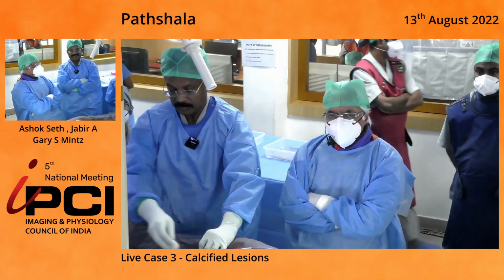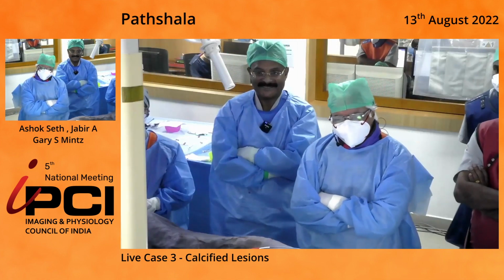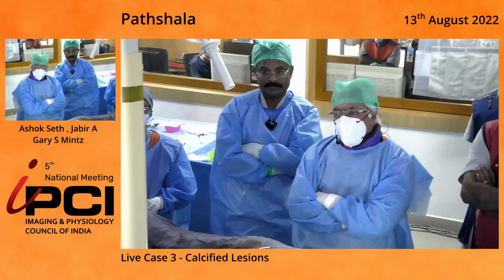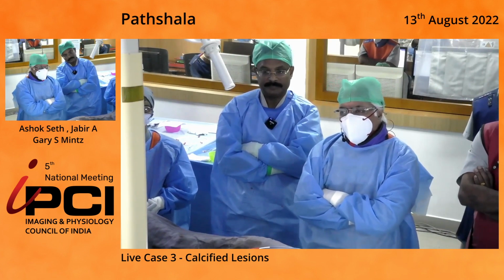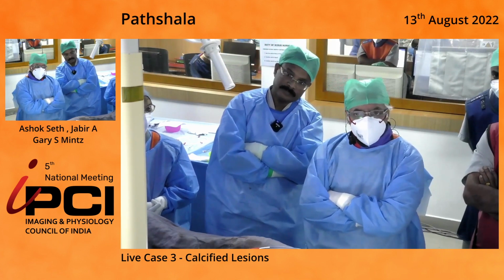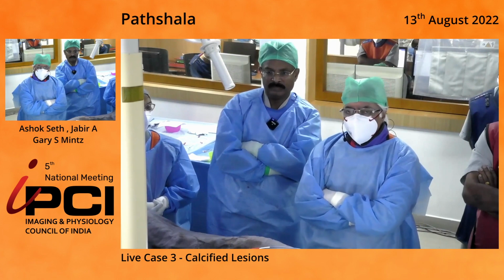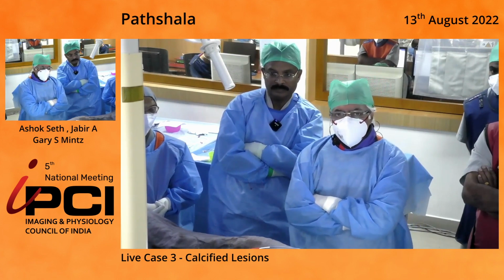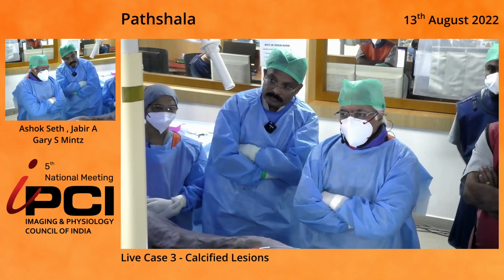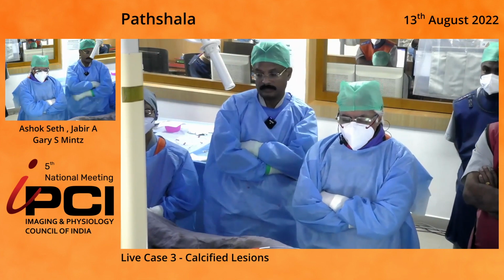But aside from IVL, are there other potential strategies to consider? And would someone use something else besides IVL? An OPN balloon. Okay, so I think an OPN balloon is a potential strategy as well. Anything else? Before that, I think we should look for any coagulation problems with the patient, like protein C or protein S deficiency, because she had multiple stent thrombosis.